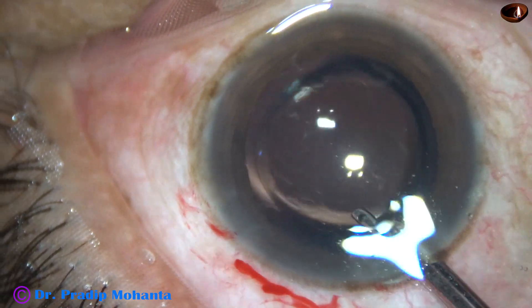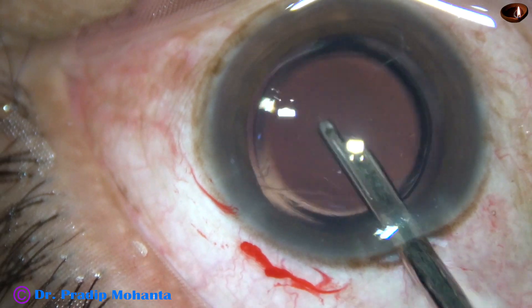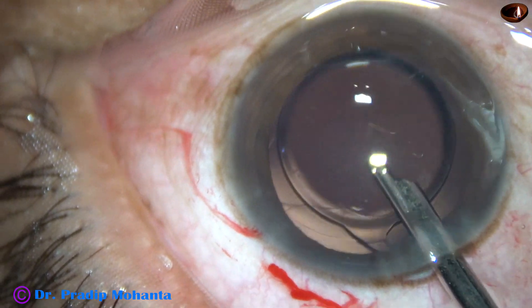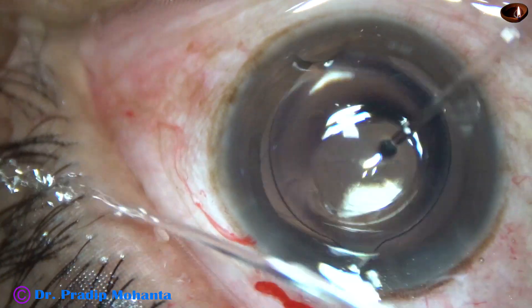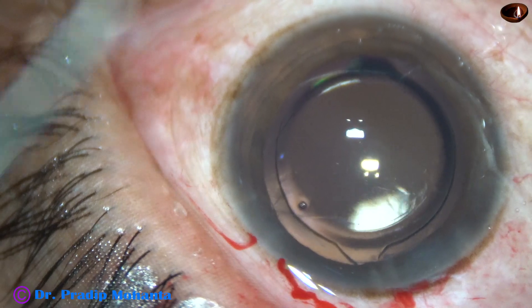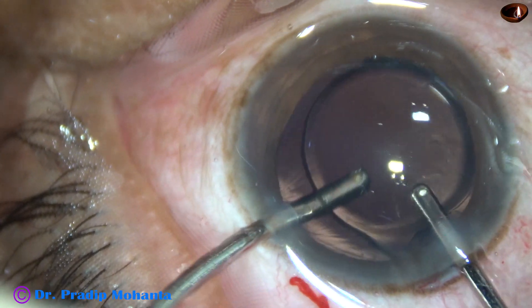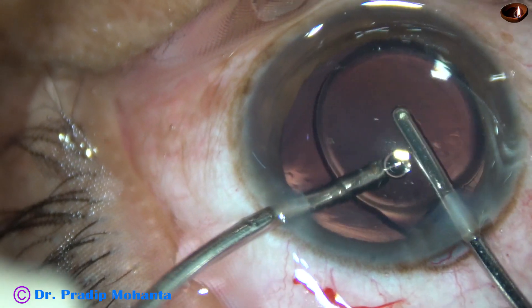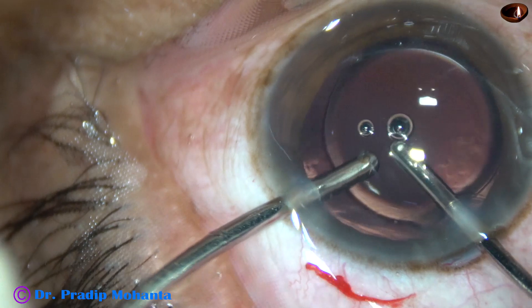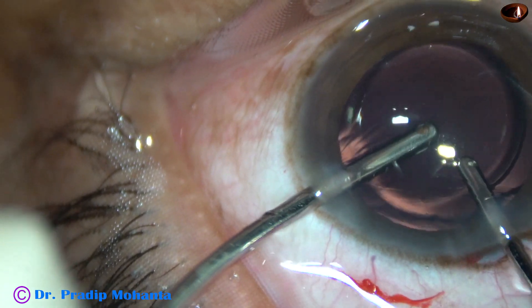Now I use the 23G Simcoe to remove viscoelastic by irrigation and aspiration from the anterior chamber. The haptic is in such a position that I cannot go behind the IOL with this. But I can go behind the IOL and irrigate the capsular bag going through the side port with bimanual irrigation and aspiration. So I'm irrigating the bag and aspirating from above the lens, and thus all the viscoelastic from the capsular bag was aspirated. The viscoelastic has been nicely cleaned.